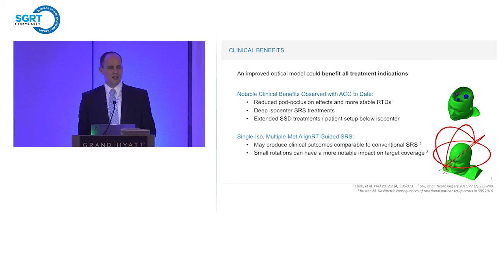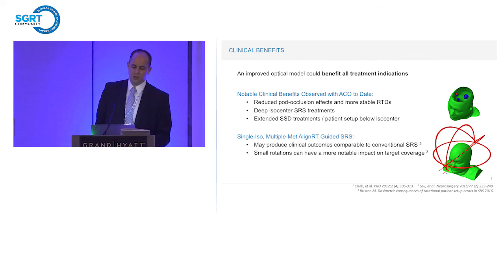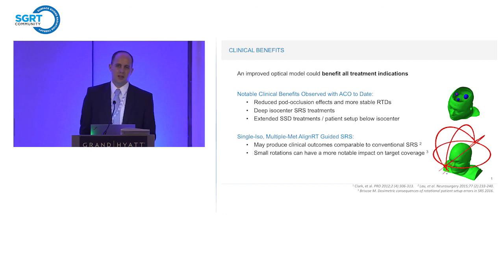And I think these kind of techniques are becoming much more popular. We discussed HyperArc earlier. I think that's a great application for this type of treatment, and just more conventional LINAC-based opportunities for this as well. So I think there's a real need to kind of drive towards the best accuracy we can get. I think the data we've seen from ACO is a great step forward, and I think could add a lot of value in the clinic.